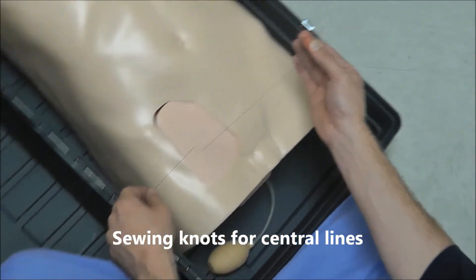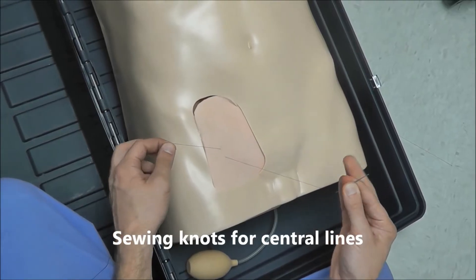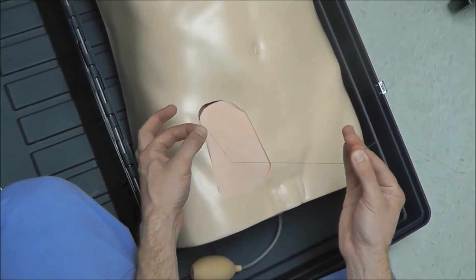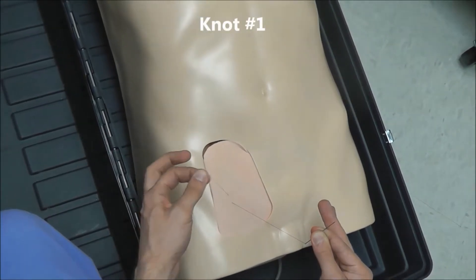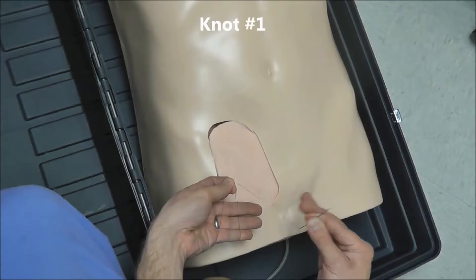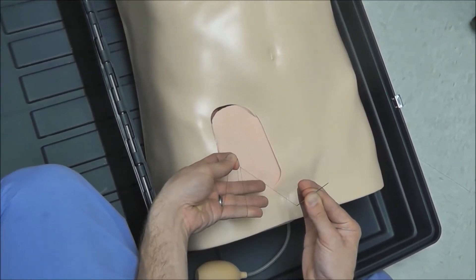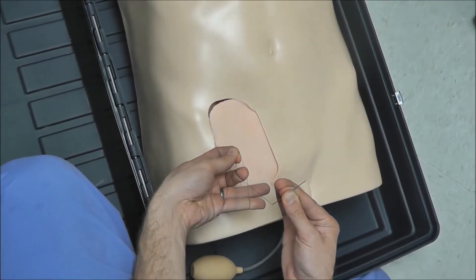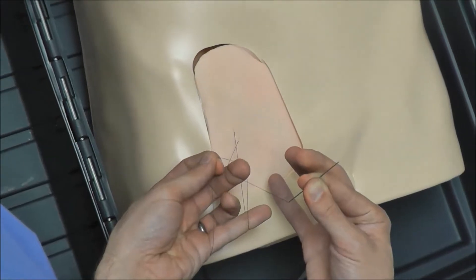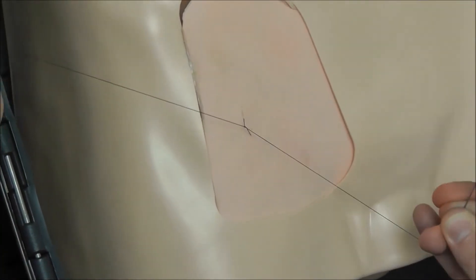So you've got this line on your right and this line on your left. You hold it with the two lines with your thumb and your index finger. With this line on your left, you're just going to wrap it on top of your three fingers. You've got this line on your left and this line on your right — pull the right line underneath the line on the left. Then you see there's this little hole there; pull that line on your left through the hole. That's the first type of knot.